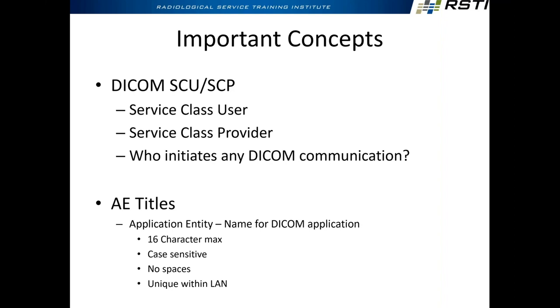In an example, if I'm sending an image to Curtis, I'm the modality, he's the PACS. Who's providing the storage? If I'm sending an image, he is. So he is the server, he's the SCP, service class provider. I'm using the storage service that Curtis is providing. Does that kind of make sense?